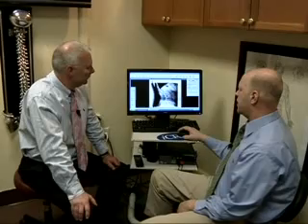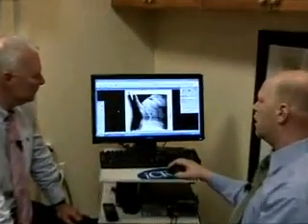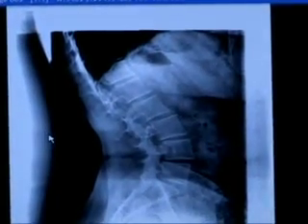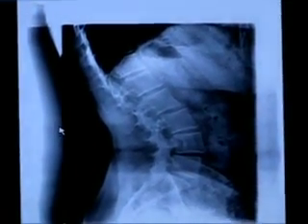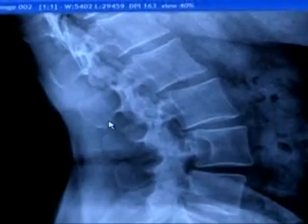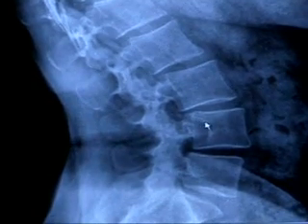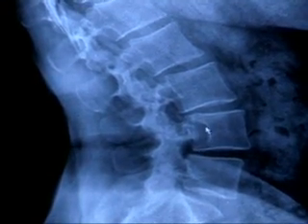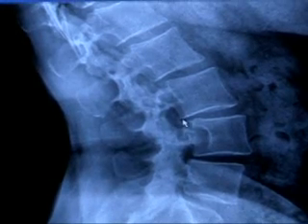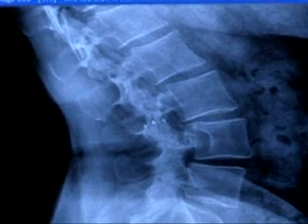And in this case also, we have a patient here that actually had a tumor on her spine, and looking at it in a regular traditional analog image, we were unable to see it. But if we look at it here, we can see the difference between this bone and this bone. We can see kind of like a half circle line here. So that would indicate a red flag. What doesn't look like the other. We can also see here that there's actually a displacement of this bone going forward. So we know that there's a weakness at this level.